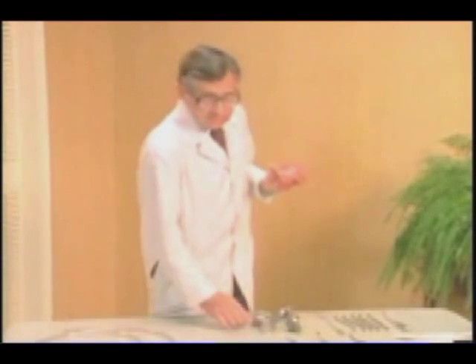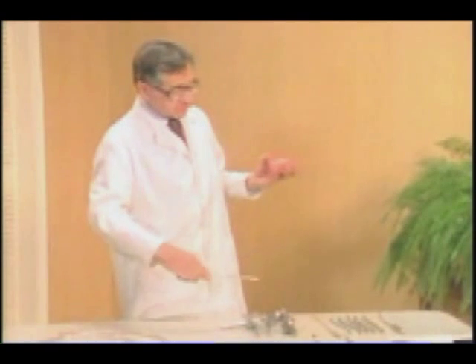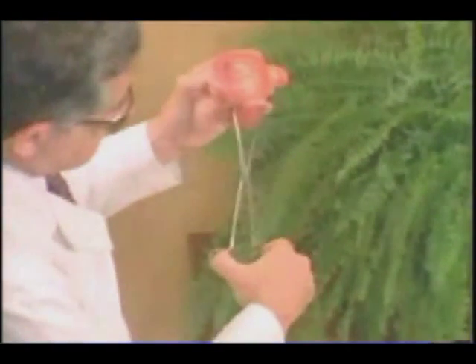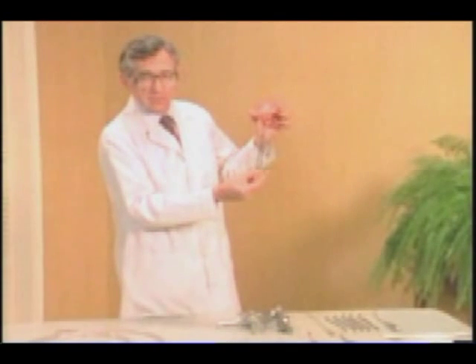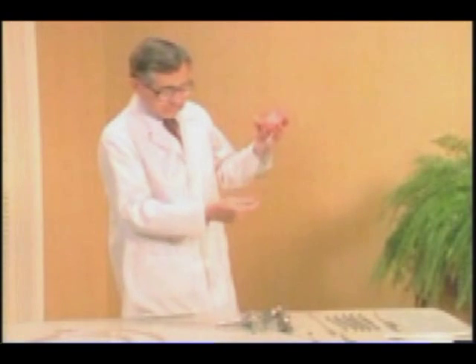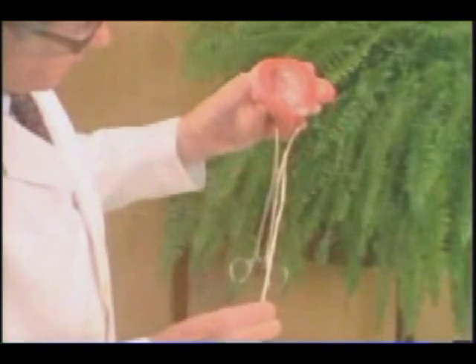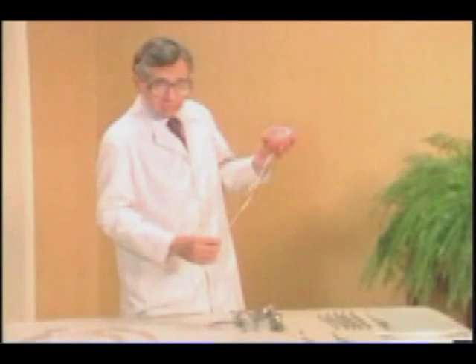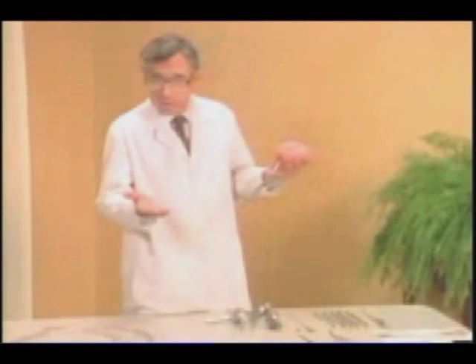Having visualized the cervix, the abortionist then takes this instrument, which is known as a tenaculum, and fastens it securely through the speculum onto the cervix in this manner, clamping shut the tenaculum and getting a firm grasp on the cervix. The next instrument which is brought into play is called the sound. This instrument is then introduced into the uterus, and it is then removed, the abortionist having ascertained exactly how deep and, in fact, how large the uterus is.